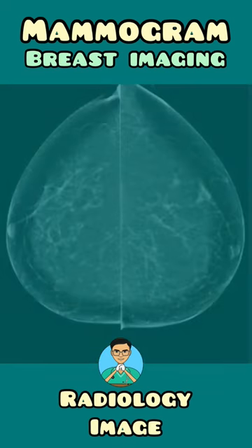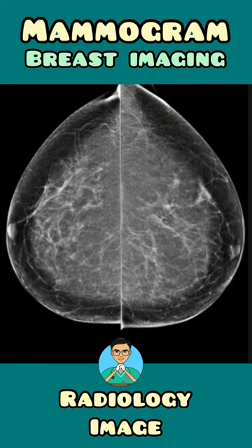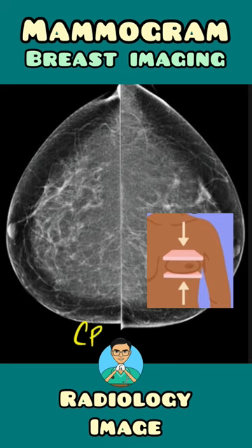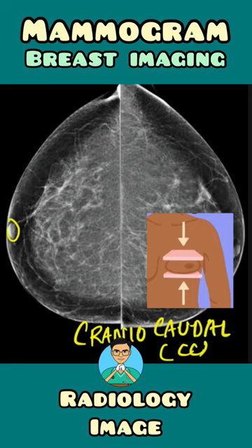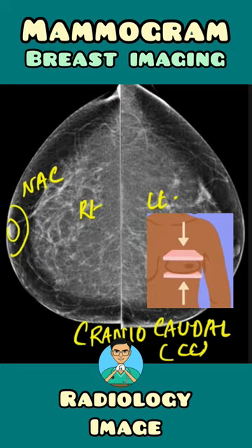Similarly, we have another view which is known as the cranio caudal or CC view. In this view you can also see the nipple areola complex and the breast substance. This is the right breast and this is the left breast. However, you cannot see the pectoralis major muscle in this view.